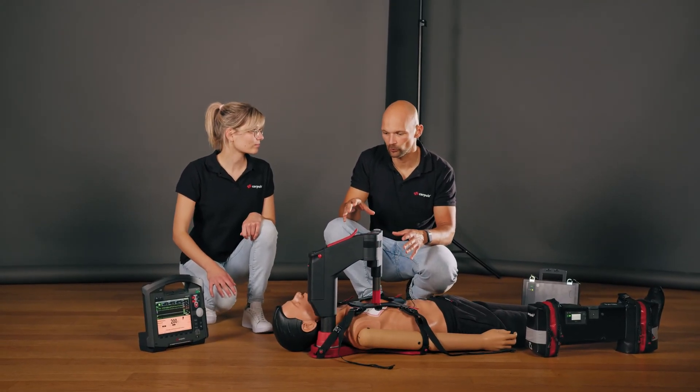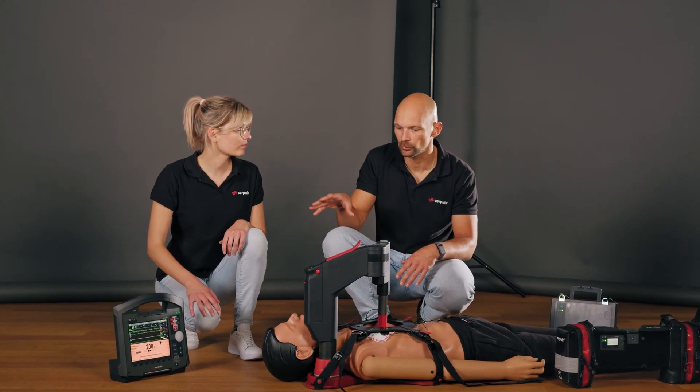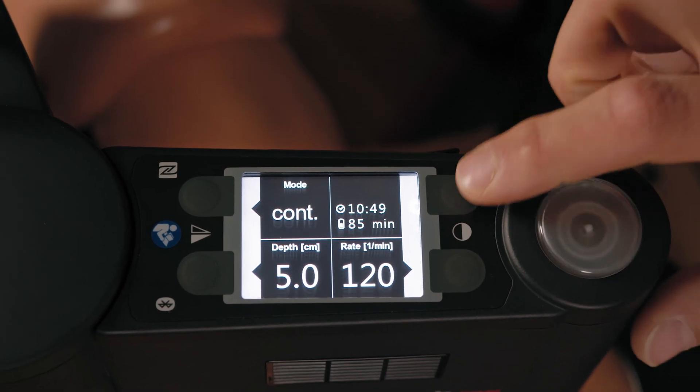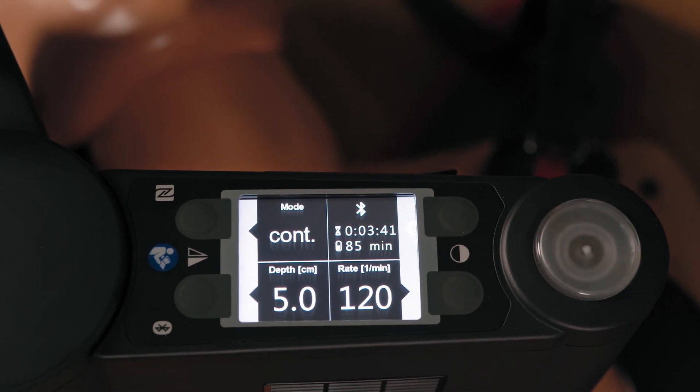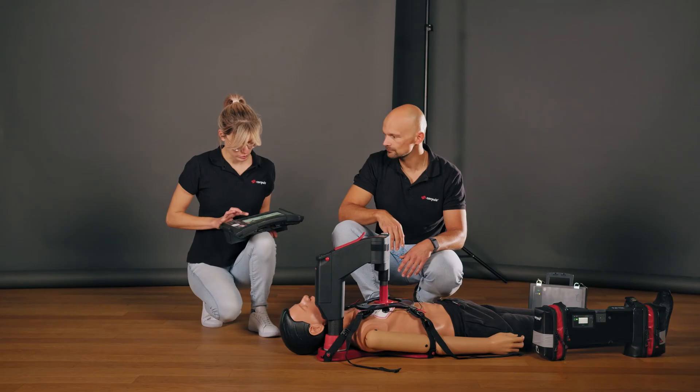We are now at the point in the simulation where we can briefly look at the synchronization of the devices. To do so I need to start the discovery mode. It has started. Then I'll search for the device.